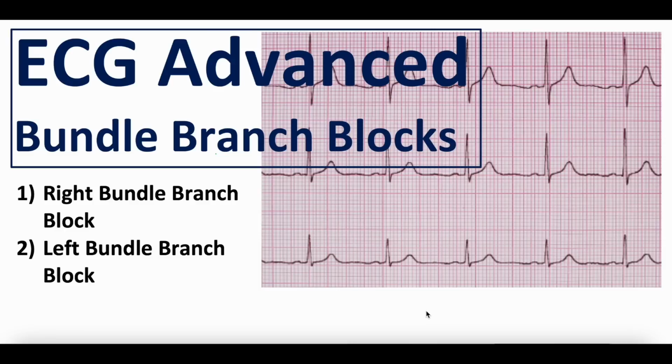We're bringing you another Whiteboard Medicine Essentials video today, where we bring some videos back from the archives and put them together into a higher-yield, more comprehensive video. Today we're doing advanced EKG: bundle branch blocks, specifically right and left bundle branch blocks. How do you diagnose them? Why are they relevant? What makes them different? What makes them similar? We'll go through them on actual 12-lead ECGs. So stick around, quick 30-second break for the introduction. Don't go anywhere, then we'll dive into bundle branch blocks.